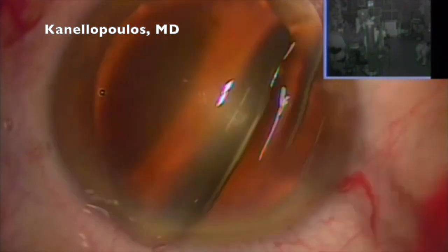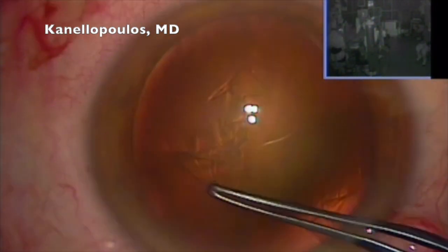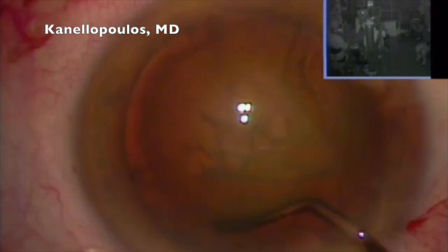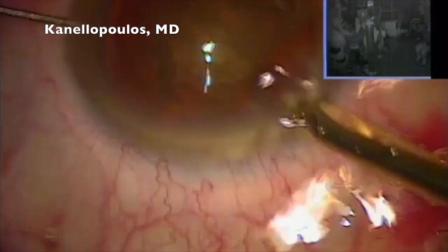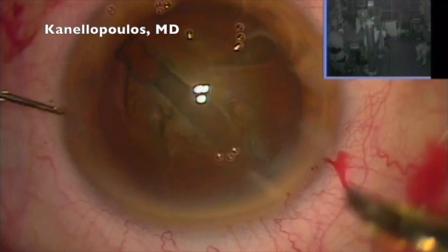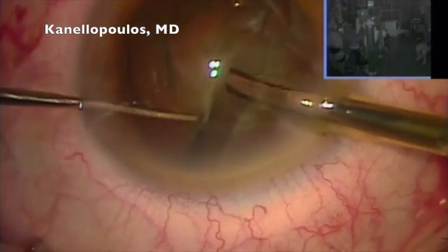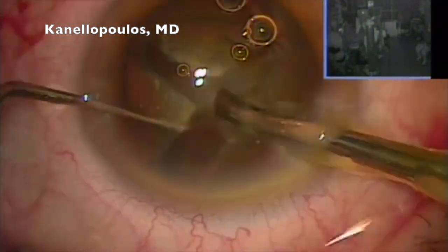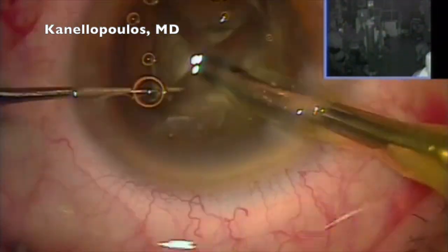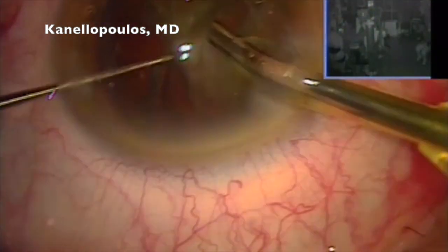We can tell this is more of a cataract. Same technique, coming in, incising the anterior capsule, continuous curvilinear capsulorhexis, courtesy of Dr. Thomas Neuhann of Munich. I'll never forget the first time I saw the video of his procedure and him introducing this procedure. Obviously, I was very privileged to have trained in New York City and operated in the actual room where Charles Kelman developed his Cavitron and phaco surgery. And here we are so many years later using his technique.